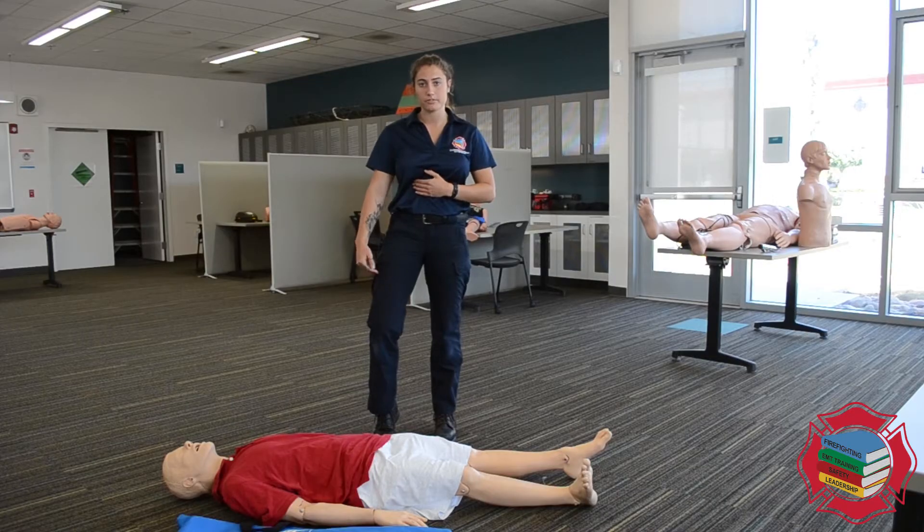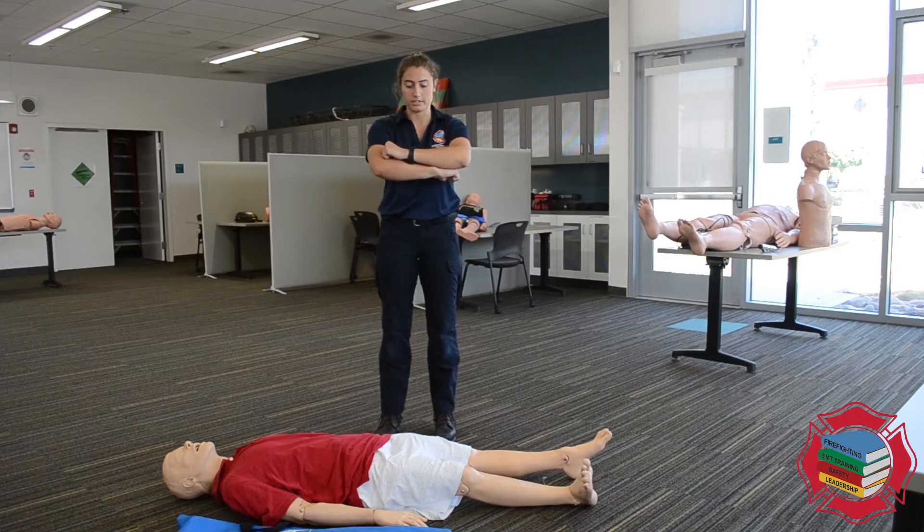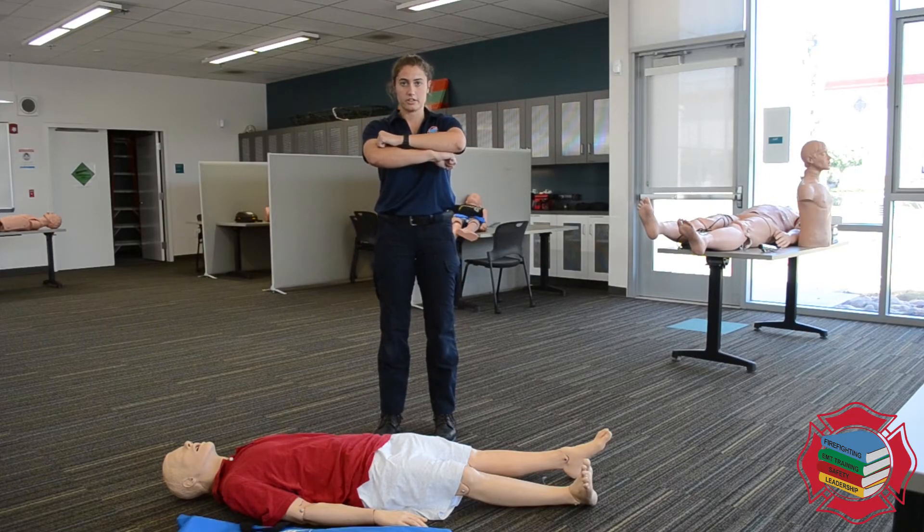What happens with a midline femur fracture is that the bone is going to slide, creating a large cavity for blood to fill — so it's a bleeding issue — on top of the fact that it's extremely painful for the patient. Once you have traction, you're never going to release traction.